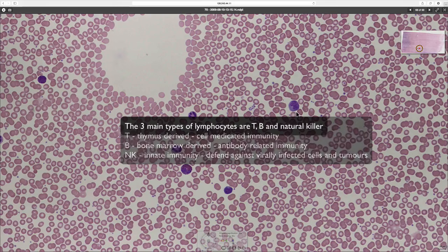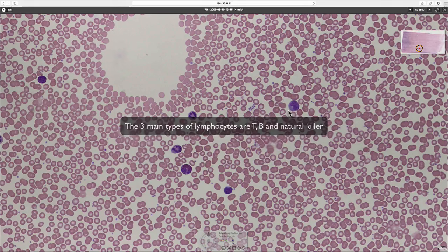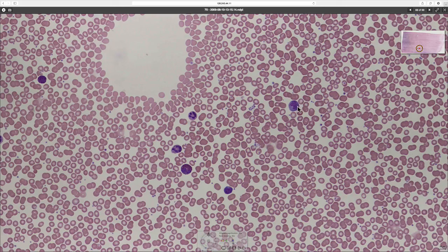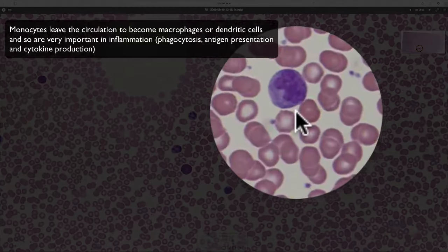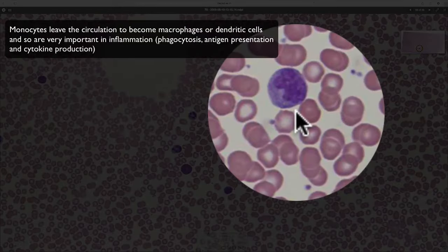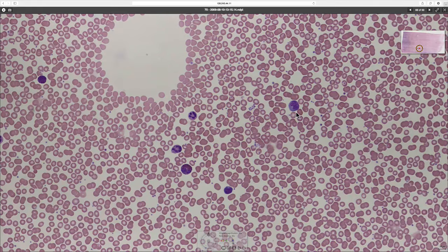The final cell type is the monocyte. It's quite a large cell with pale cytoplasm — no granules — and a kidney bean-shaped nucleus. Monocytes are also involved in fighting infection. They are present in small numbers in the blood, but once monocytes leave the blood they are called macrophages, and you find them in greater numbers in tissue as macrophages than as monocytes in the blood.